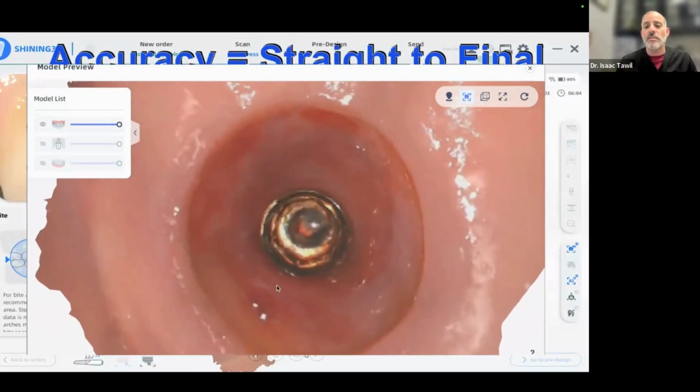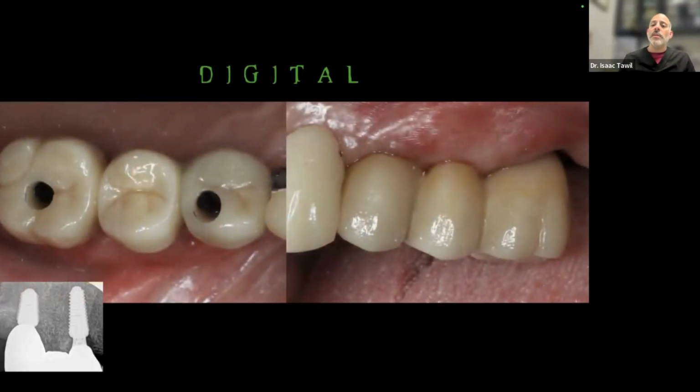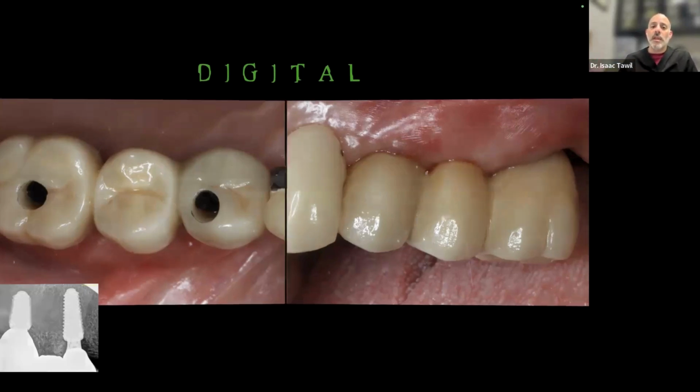Obviously, we use scan bodies, but you can just see how well it captures the sulcus so deep into that area. And we're able to go directly to the implant fixture with this device going with a 3-unit bridge. I wouldn't go more than 3 units. I don't believe that you can capture accurately more than that, but we can be truly digital. We did this case modelless, and we are able to make a 3-tooth fixed partial denture, screw-retained with engaging abutments. You see on the lower x-ray there, the hexagon has not been removed. It is in there, and it was engaging that conical connection as well. So that shows me that the scanner is pretty accurate, but only for a limited field. I wouldn't go more than that.